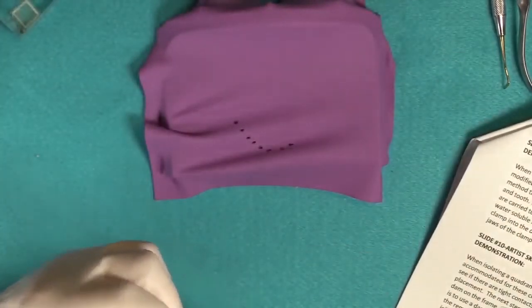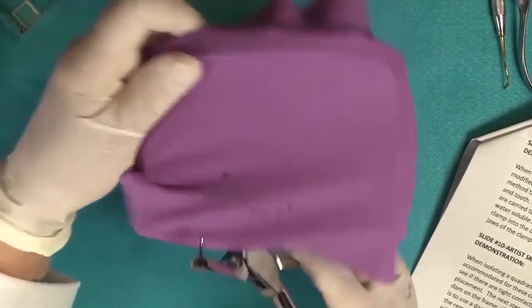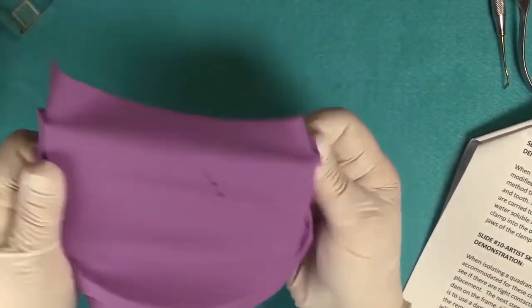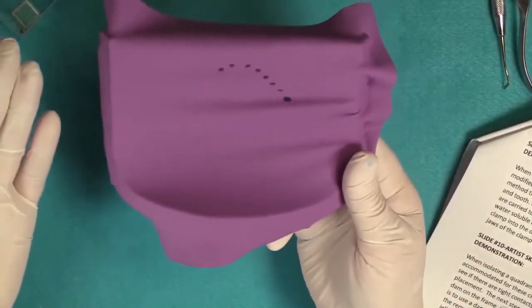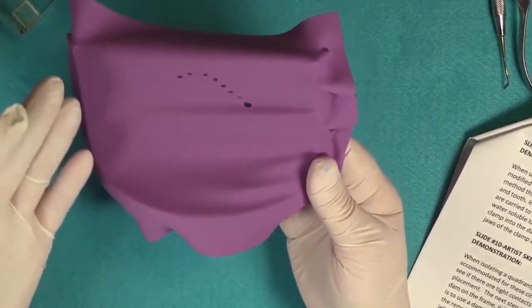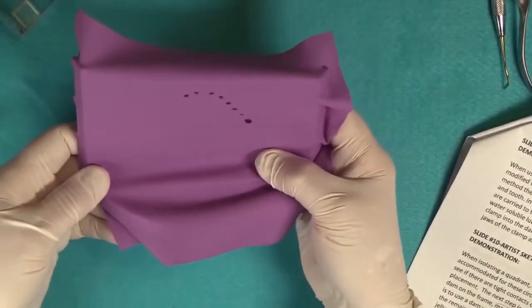So what happens sometimes is you may get a little leakage. So if you notice that the person's teeth are maybe a little smaller than normal, I would go the whole size smaller. How the non-latex differs from the latex product, other than the fact that it's non-latex, is that they've adjusted the modulus of elasticity. Now, that's basically the stretchability of the product, you know, all these fancy terms. But non-latex dam is easier to stretch because the modulus is lower than the latex product. So that's the reason. All right, so we have our dam all set up.